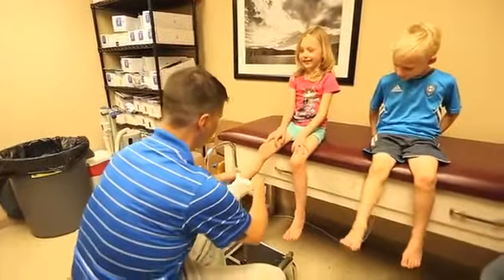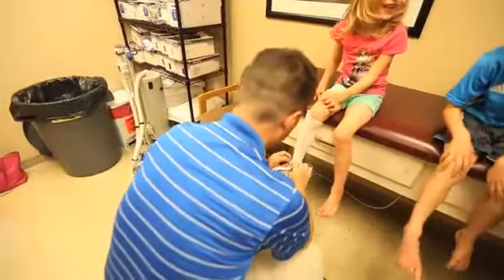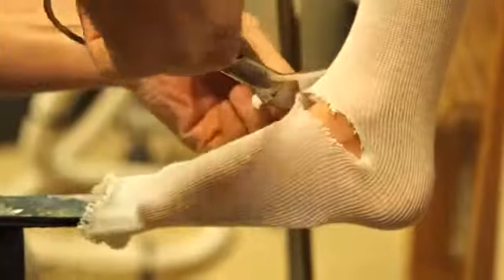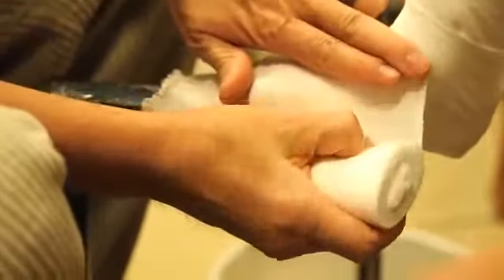I'm gonna make a hole so there's not a wrinkle in the front of your ankle here. We're gonna put some padding on your leg. This is to keep the cast comfortable.